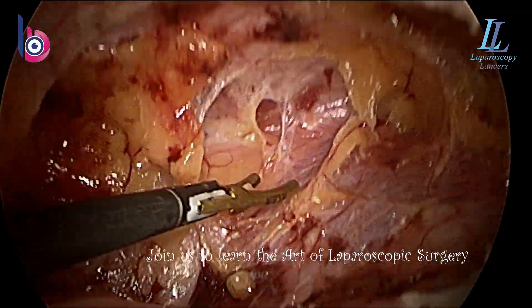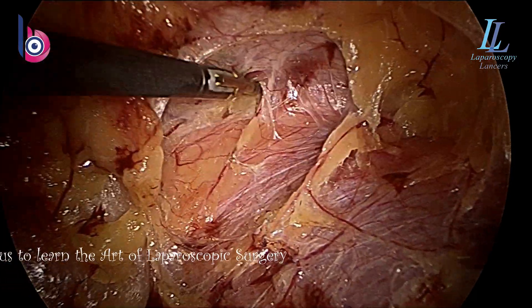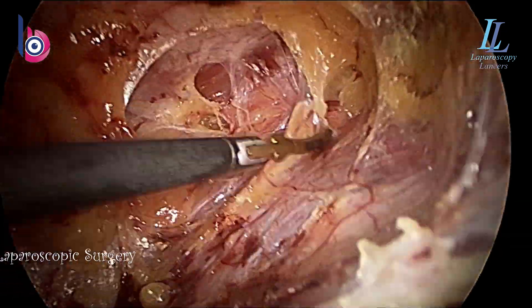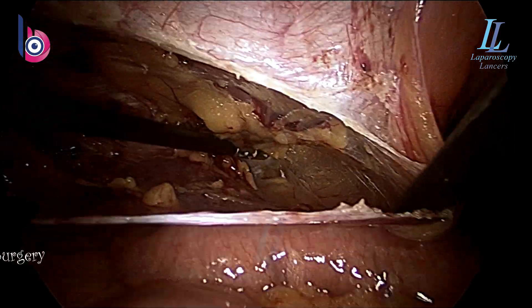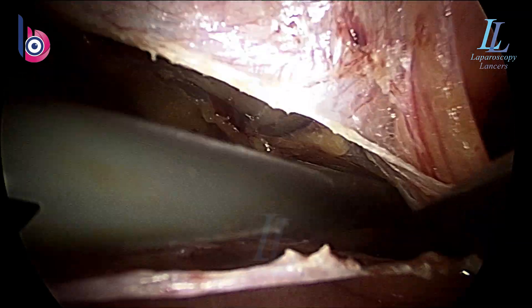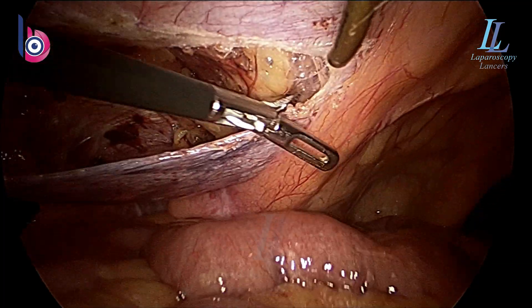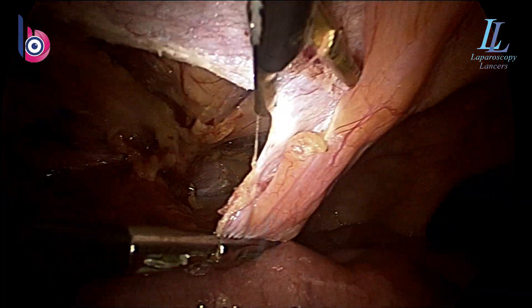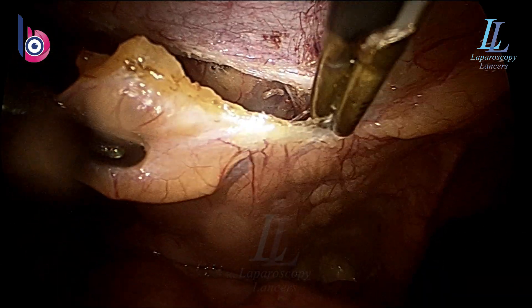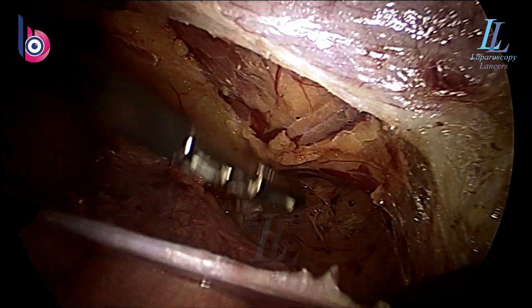Here you can see the transverse fascia that I have lifted. The muscle is getting bared. I have lifted the fascial layer on the muscles so that post-operatively these paresthesias don't happen. The dissection continues. From the ipsilateral side there's a bit of difficulty reaching the retropubic space, but that's enough. The peritoneum I have dissected a bit less, so I'll go back and cut around a centimeter of peritoneum more, and I'll be cutting half of the medial umbilical ligament — that will make a good space for the medial dissection.